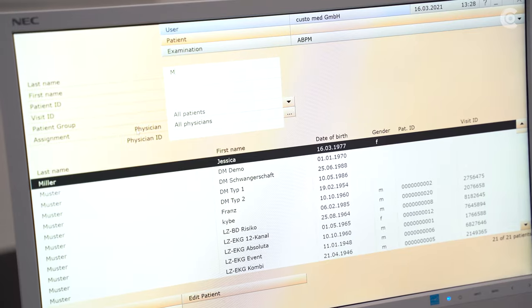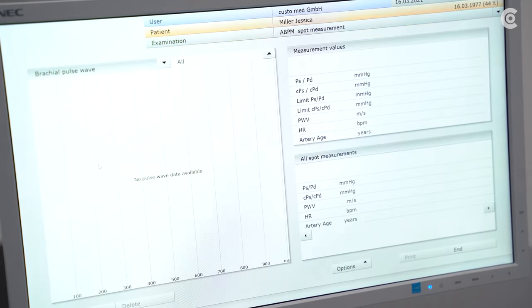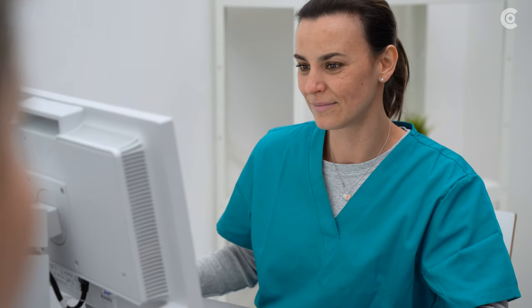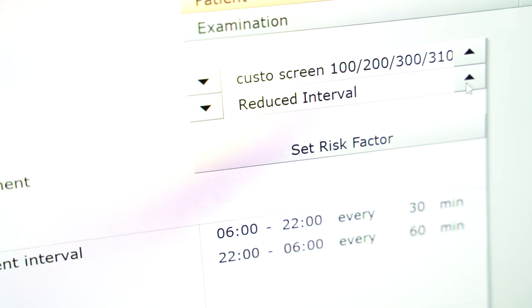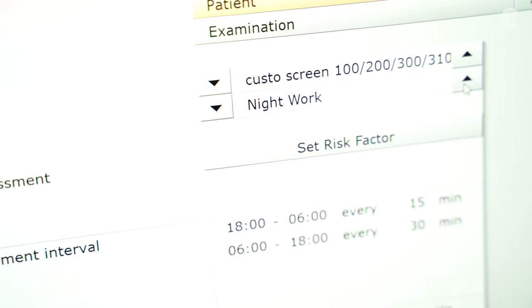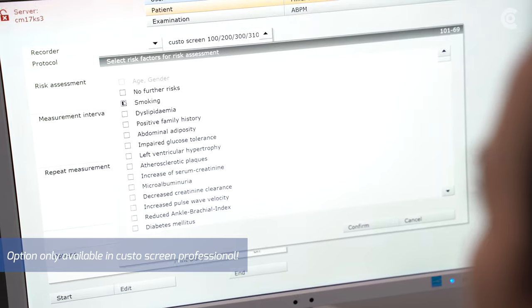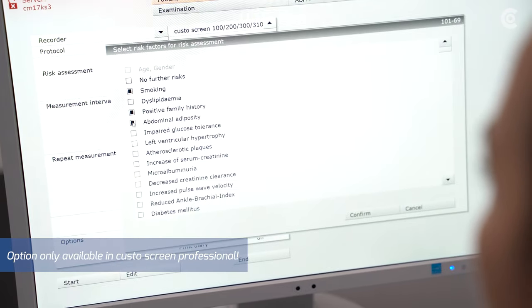Then create the patient data in Custo Diagnostic or import already existing data. In addition, decide upon suitable start parameters, which are defined by different measurement intervals and repeat measurements. Select the risk factors which apply to the patient — this option is exclusively available in the CustoScreen Professional version.